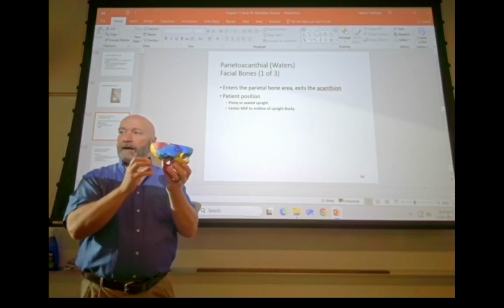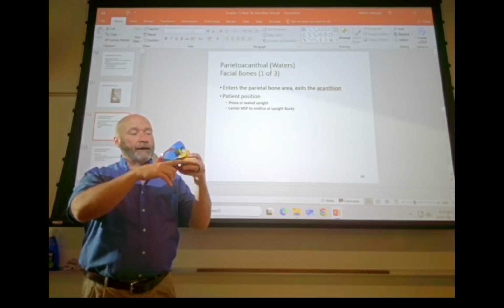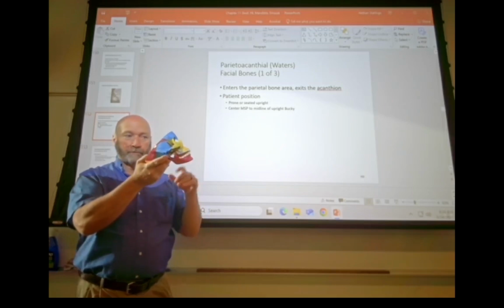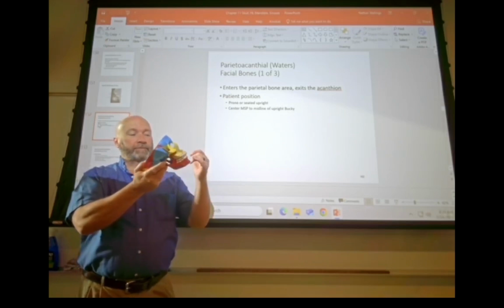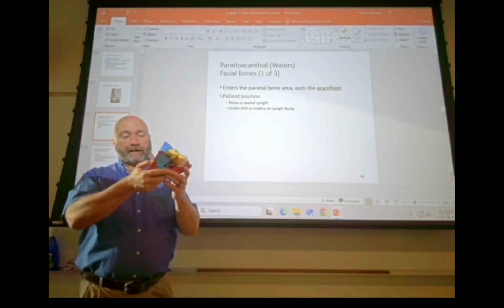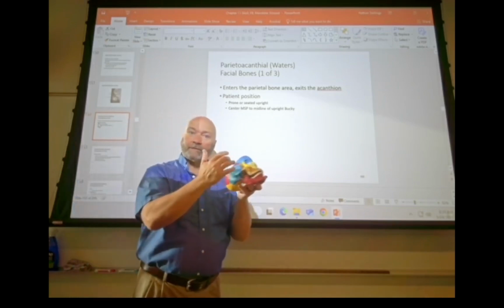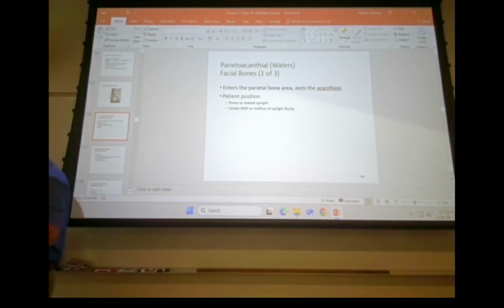With it down like this, we might have some petrous ridge in the maxillary sinuses. So if we pull back far enough, I can drop my petrous ridges below the floor of the maxillary sinuses. So pull my chin back far enough so that the mentomeatal line is perpendicular to the image receptor. That places the petrous ridges below the maxillary sinuses so that the maxillary sinuses are the sinuses of interest. Okay, that's for sinuses. Now, what do I see in facial bones with the Waters?